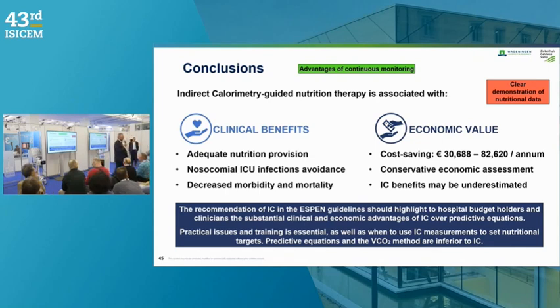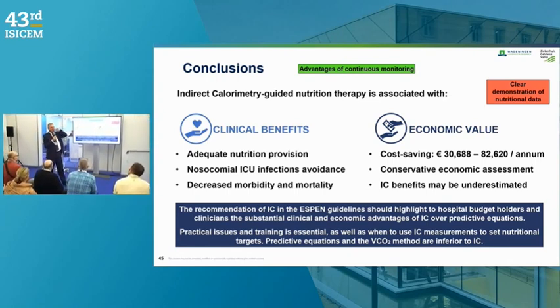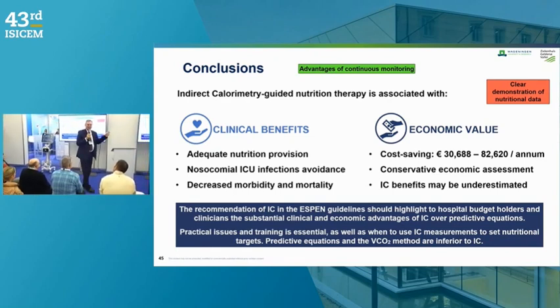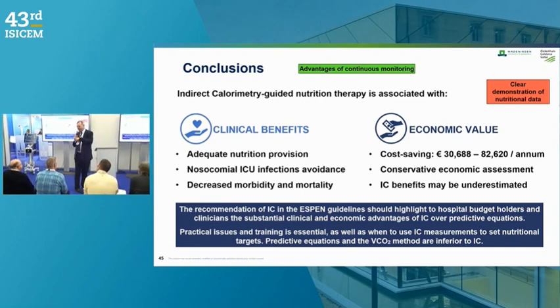But is it possible based on the substrates you've seen? Can you have 0.49? It's very low. Or you have 1.67. So there could be something wrong. Sometimes you have misreadings of the device. We have another device than this because we do intermittently. Sometimes there is humidity in the system. You also can have erroneous measurements.